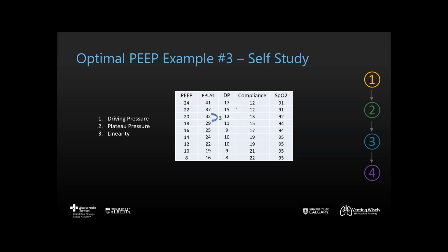We have established linearity. And as the PEEP is greater than or equal to 10, we can continue down to try and confirm linearity. So PEEPs of 18 to 16, our plateau delta is now 4, no longer linear. So now we would follow the red no to the exit criteria. Have we met the exit criteria? No. So let's continue down to set it and check it.